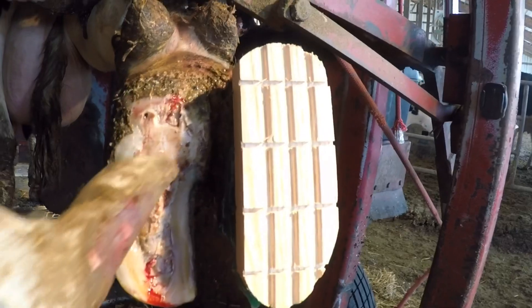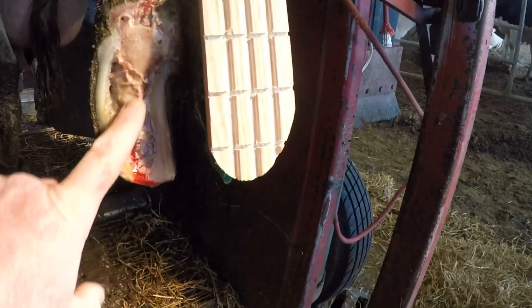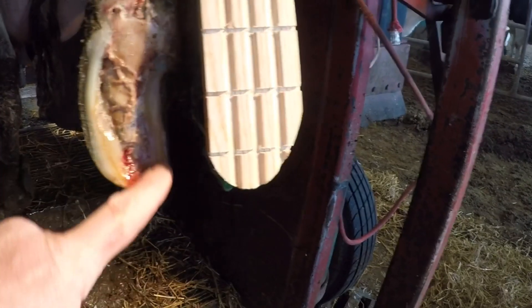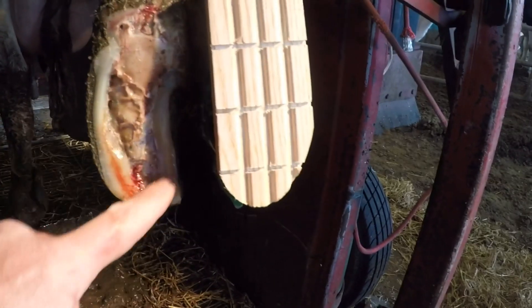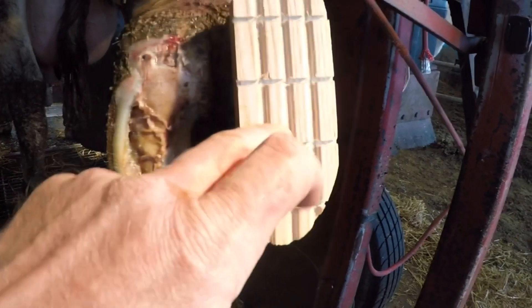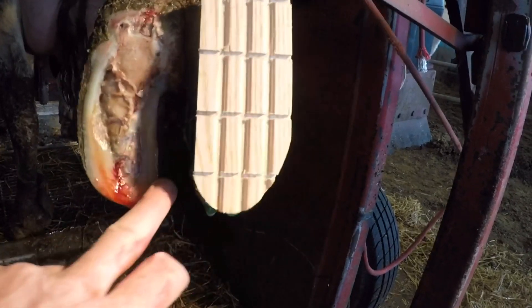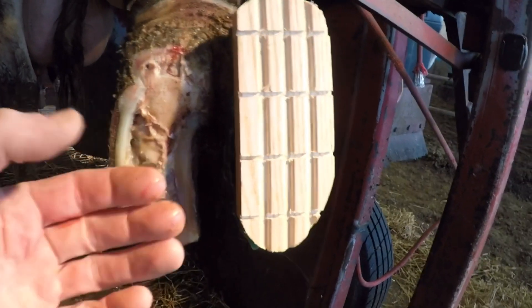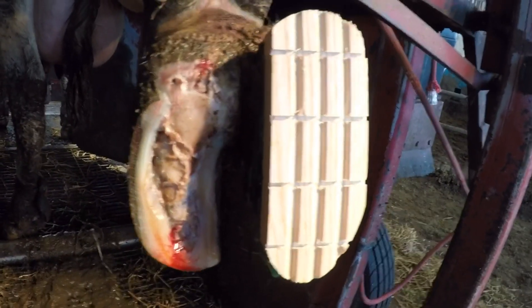And that about does it. This inner portion that I just pointed to is all soft tissue with an ulcer down there by the toe. I left this outside wall here as protection just in case that block happened to come off — I would have something to protect that ulcer area. However, in a couple of weeks when I come back to check this, I will remove more of that outside wall and get it closer to its natural state.